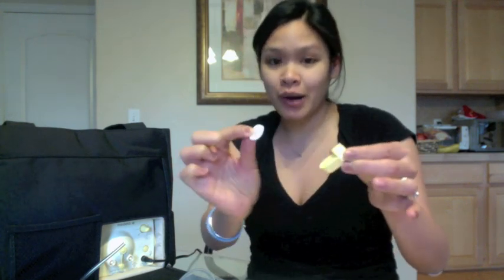But yeah, so pull it apart and then take all your pieces and throw it in some boiling water and boil it for about 10 minutes. Then go ahead and let it air dry. When you're ready to use it, to reassemble it, this thing kind of looks the same from either angle. The bottom just has a big open hole, and that's what the valve will fit into, so that's how you know which one is the bottom.